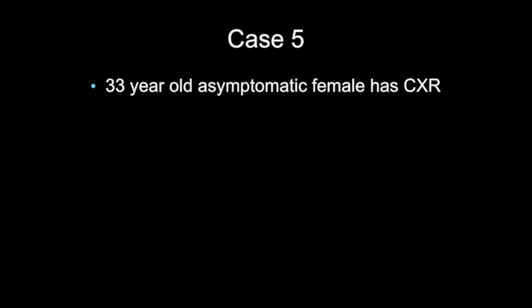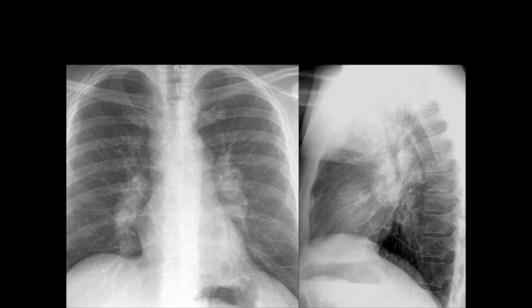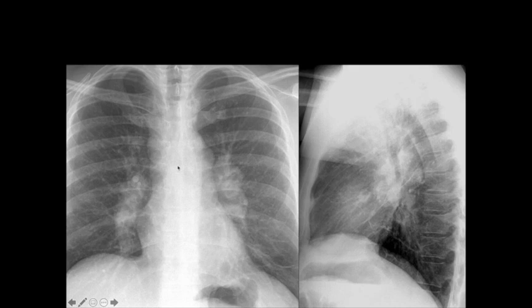Case 5: a 33-year-old asymptomatic female has a chest x-ray. Let's go through our approach. Normal heart size, position, borders. Nothing high density, no gas. Mediastinum — no shift.